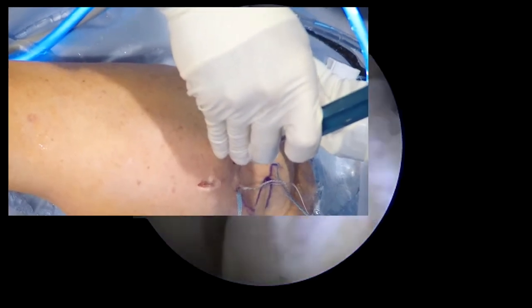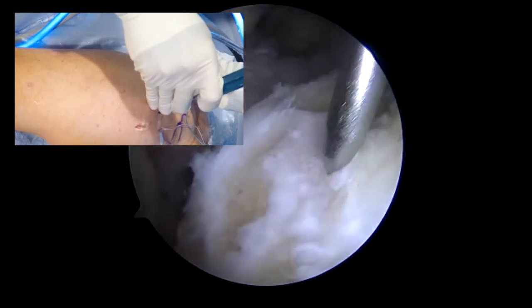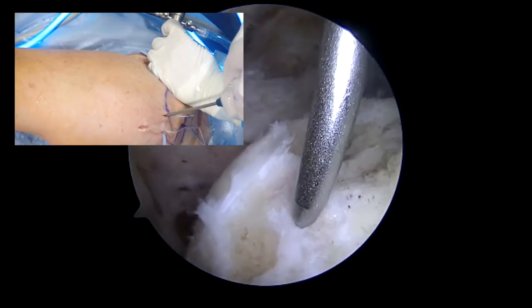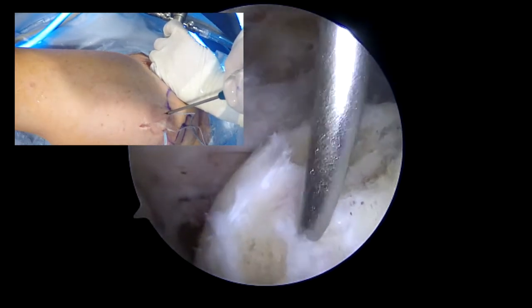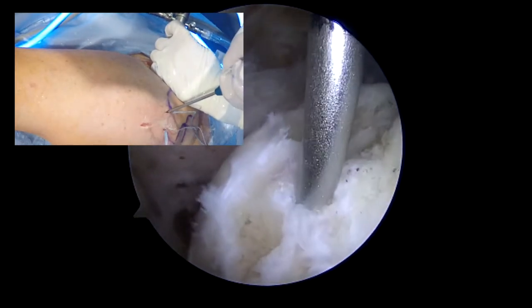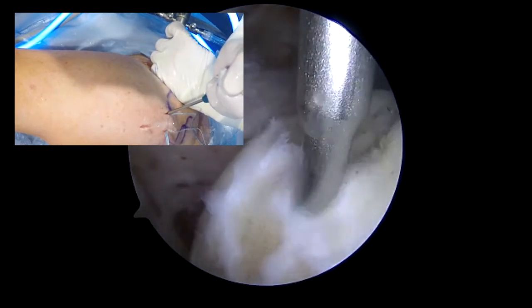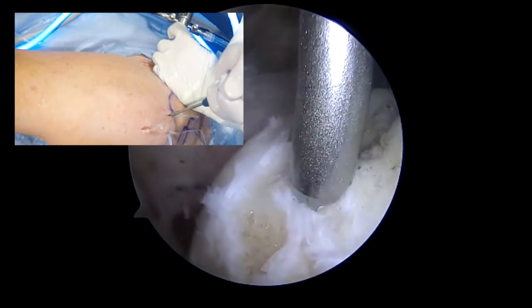In this one, we went a bit more posterior than we usually would for that same reason, in order to ensure there is good quality bone. We see fat droplets emanating here, and we can tell that this should have a good purchase for the second swivel lock anchor.